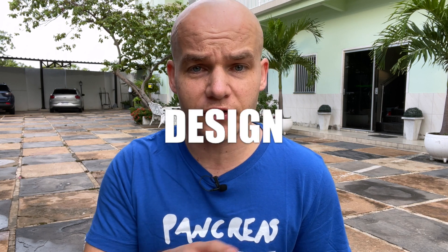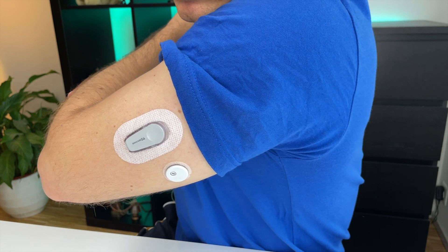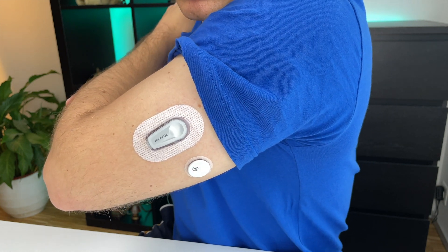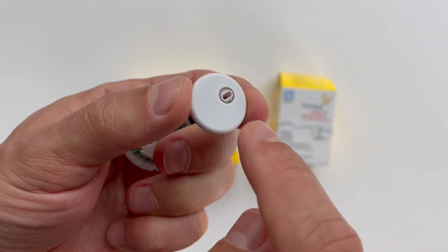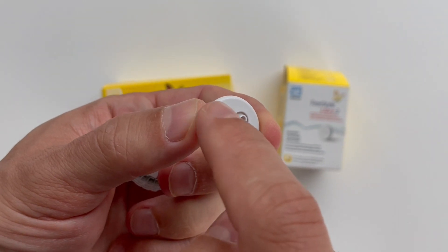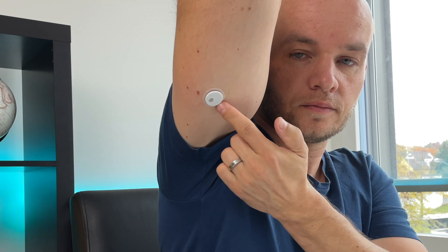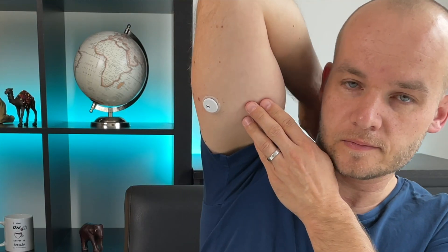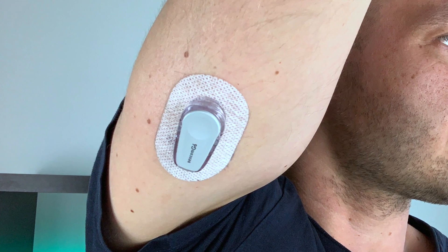The first difference between Libre 3 and Dexcom G6 is how these sensors are designed. You can probably see at the first sight that Libre 3 is a lot smaller and a lot thinner when sitting on my arm compared to Dexcom G6. The difference in size is massive. Libre 3 has a size and shape of two stacked US pennies. It's extremely sleek and really good looking and it weighs literally nothing. I've used about five of these Libre 3 sensors and I still can't believe how tiny and light they are and how little skin area they need.